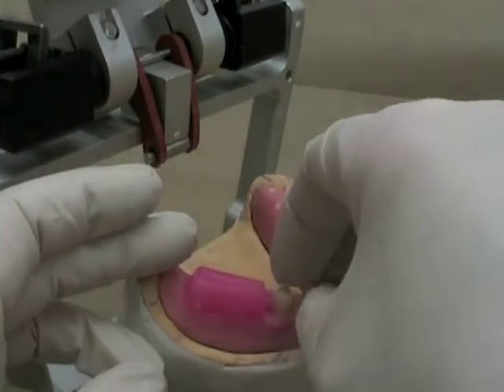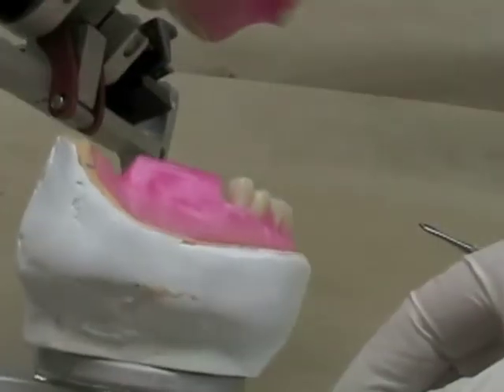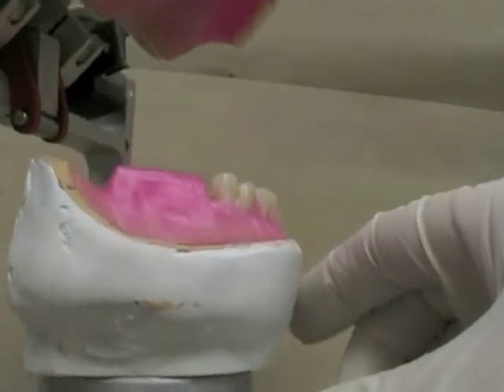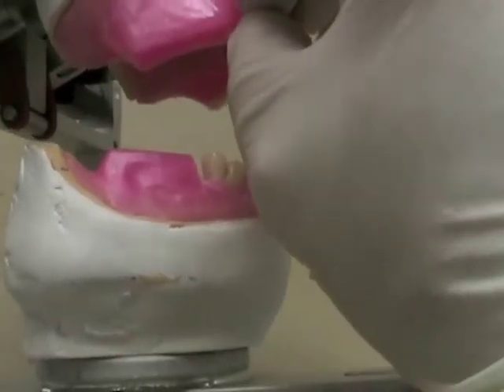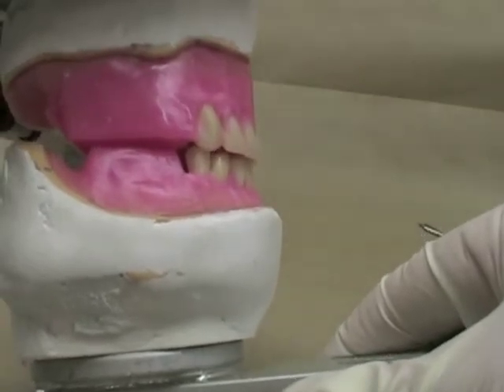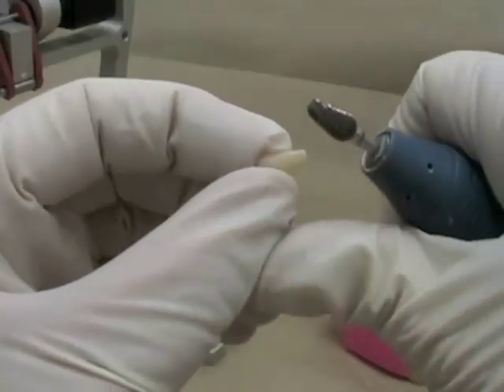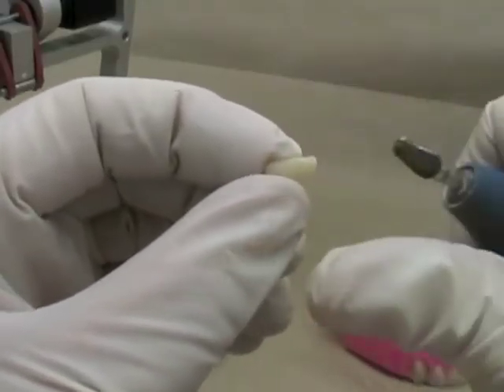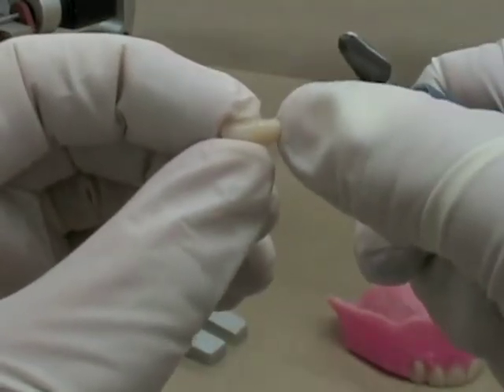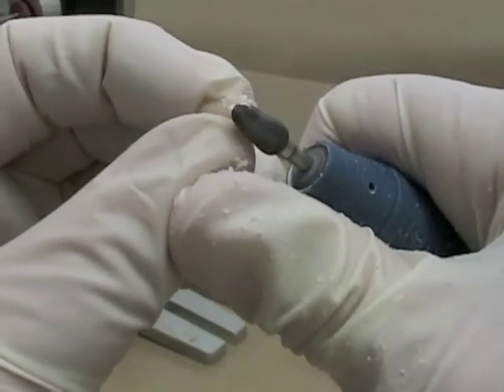I'm finding that my tooth is starting to hit the record base — you can see it's above the level of the canine. So in this particular case, I'm actually going to have to adjust the neck of the tooth so I don't end up with a huge overbite for that particular tooth. We're going to take that down, and we're not going to go past where the cervical neck of the tooth is, but we'll take off the root portion of that particular tooth.